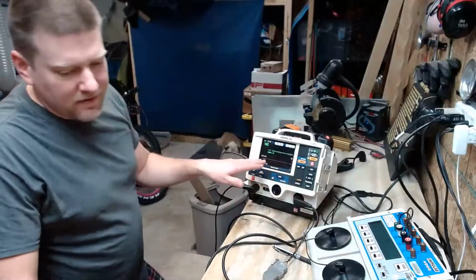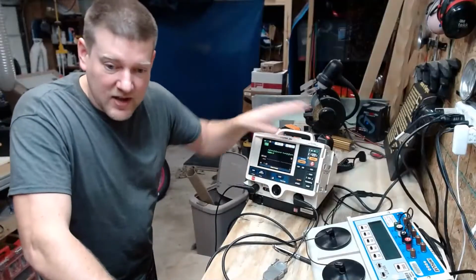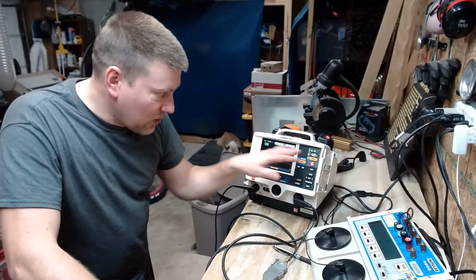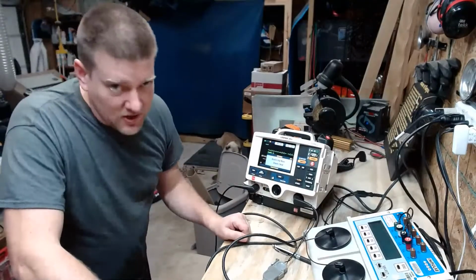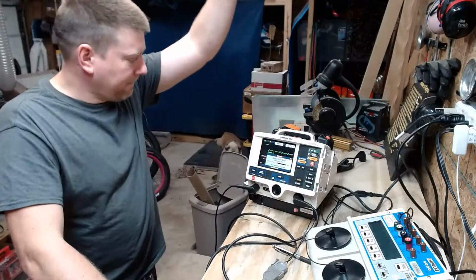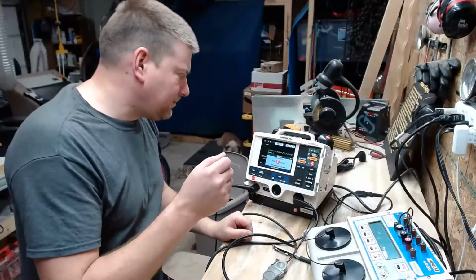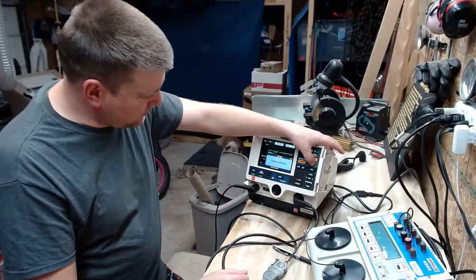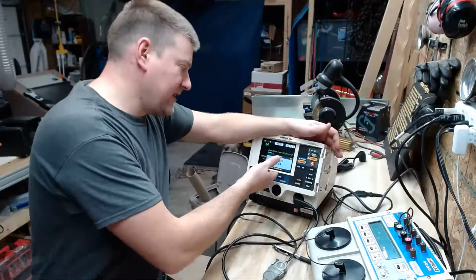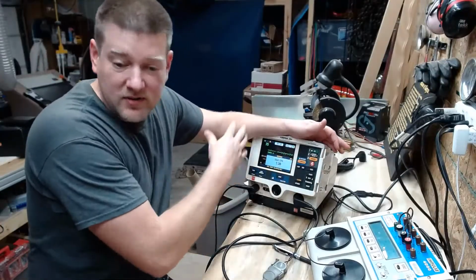Okay, so I press the Defib button and I press analyze, and it should not shock. You can see it's all over the place. There's not a defined R wave for the QRS complex. You see it's just that wavy pattern. Analyzing. It should not shock. Clear. Shock advised. Oh, it should shock. My bad. Stand clear. Push to shock. So it's going to tell you to go ahead and shock. And then over here, I have 207.1 joules. Over here, I wanted to discharge 200. Well within spec, we're good. So you go through the rest of the energy ranges, right?